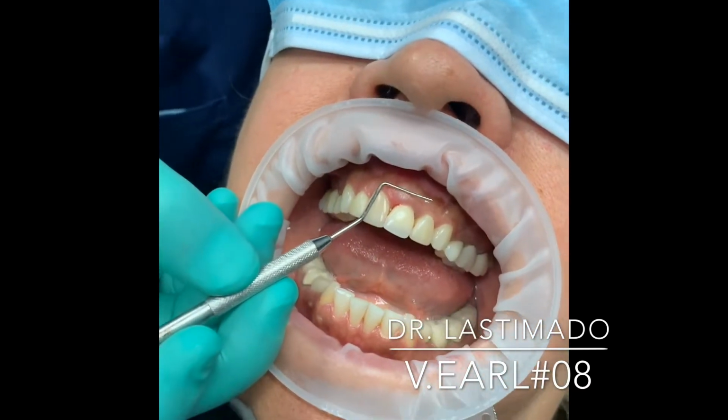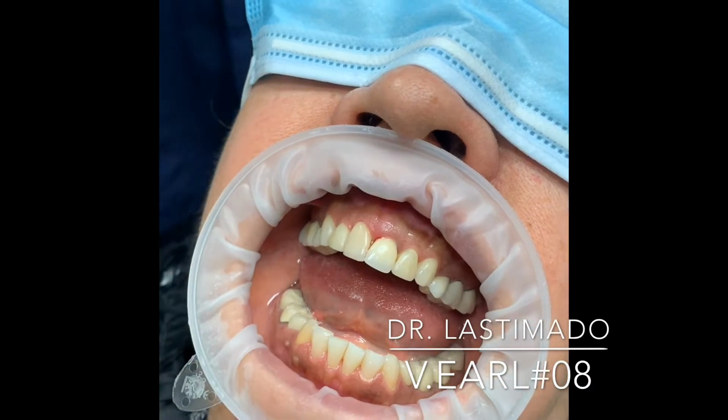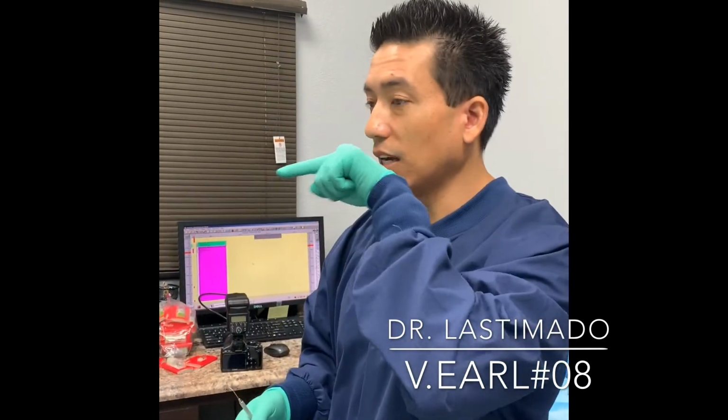What we want to do is take a pre-surgical impression and fabricate an open guide. The open guide is going to give us a visual reference of how deep we place the implant, and also for angulation, so that if we decide to do a screw-retained final restoration, the screw access hole is not going to be coming out the facial.